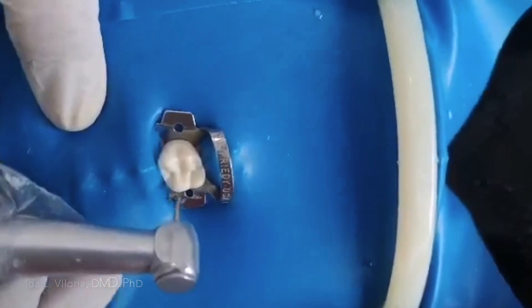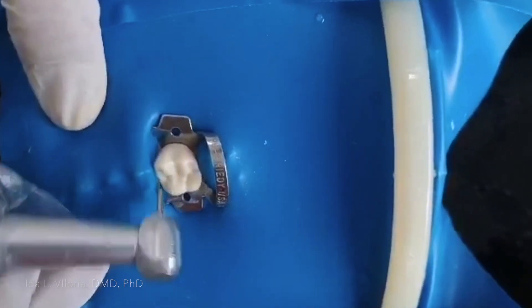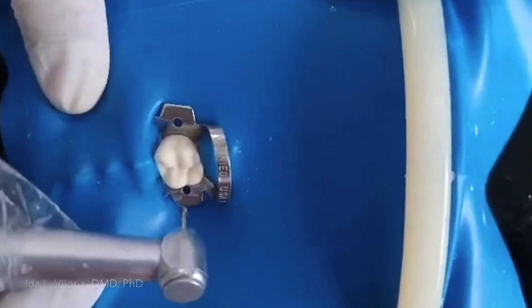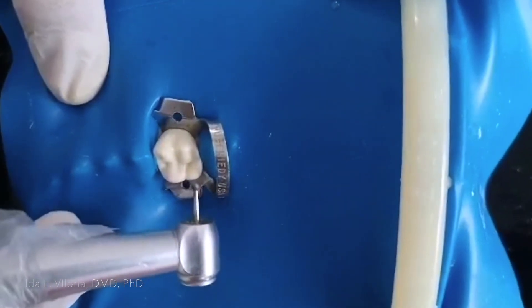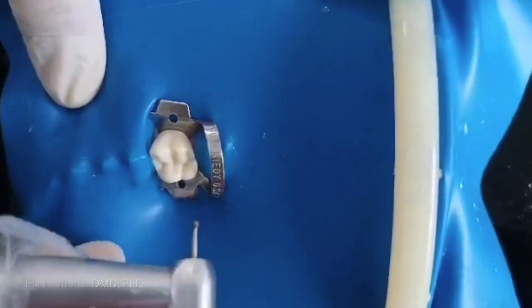I'm going to do access cavity preparation of a maxillary first molar. After studying the preoperative radiograph, I know that there's a big pulp chamber on this tooth. I will now start with my access cavity preparation — initial preparation using round burr number four.